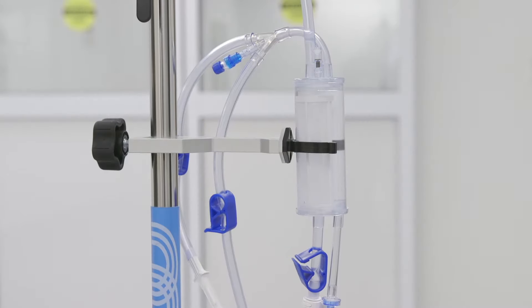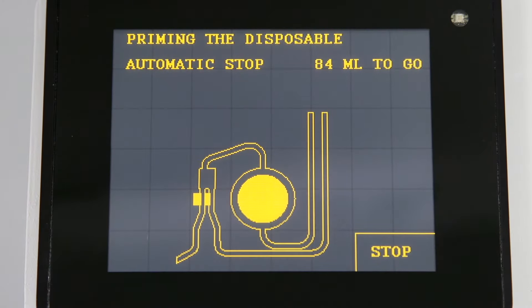The roller pump will automatically prime the system in about 13 seconds. Fluid will be drawn through the tubing while the air will be directed out through the recirculation and vent line. During prime, the 100 milliliters to go will count down to zero.